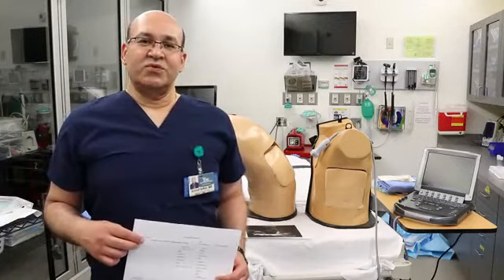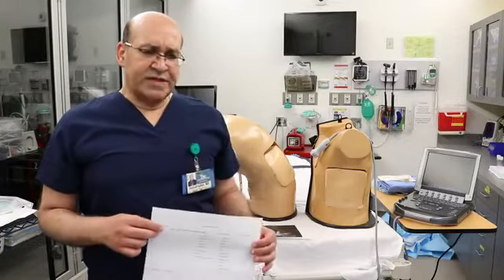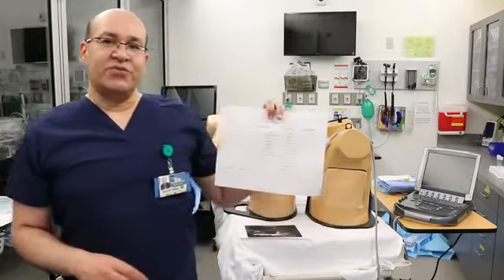Hi. Today we will talk about thoracentesis. Here from the Skills Lab in University of Missouri, Kansas City, we'll do some education video about how to do thoracentesis. And the first thing for any procedure to start with is the checklist. So this is our checklist for thoracentesis.